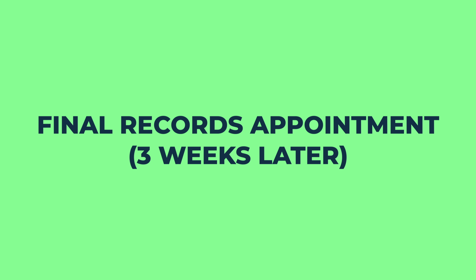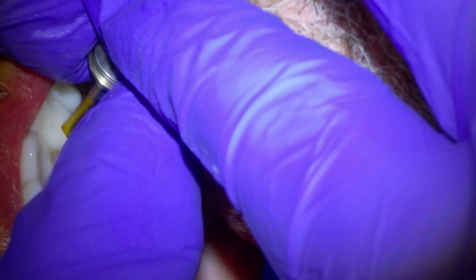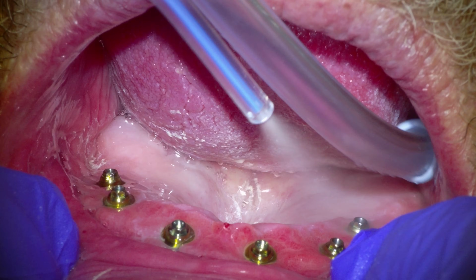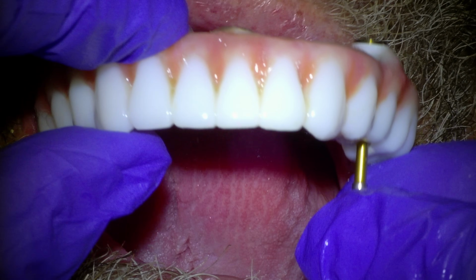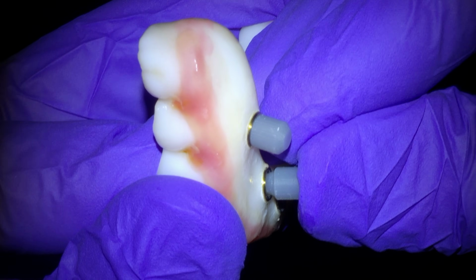So let's fast forward to that appointment 3 weeks later. And I'm just gonna go through this appointment quickly because now we just repeat the appointment that we had a few weeks ago, where we decide any changes that we want and we take pictures and scans of everything with the scan caps and the analog MU abutments and all that sort of stuff. It's all the same as that previous appointment.